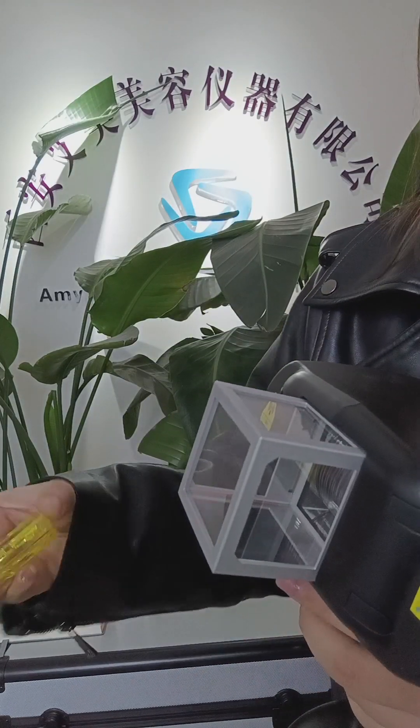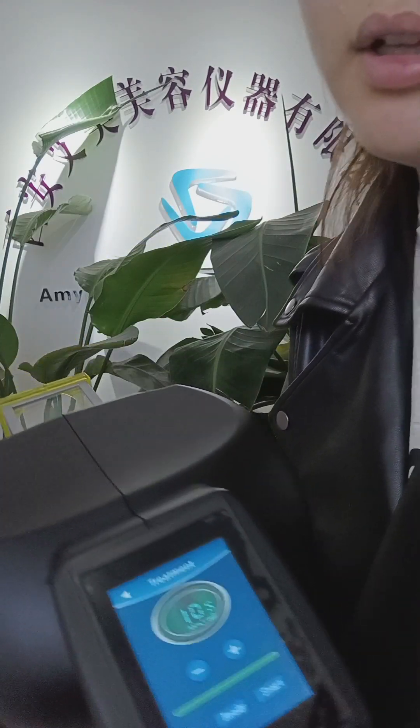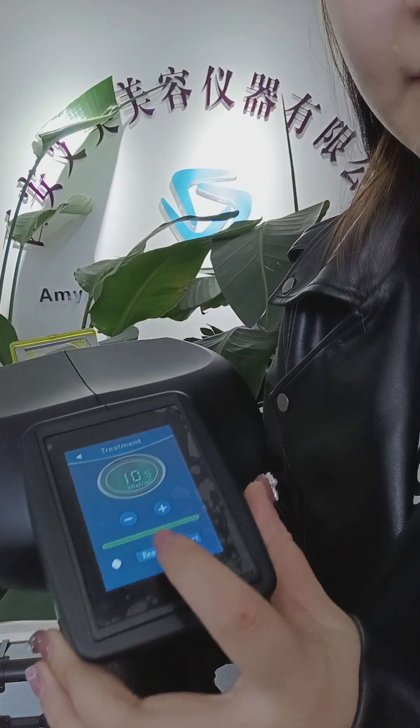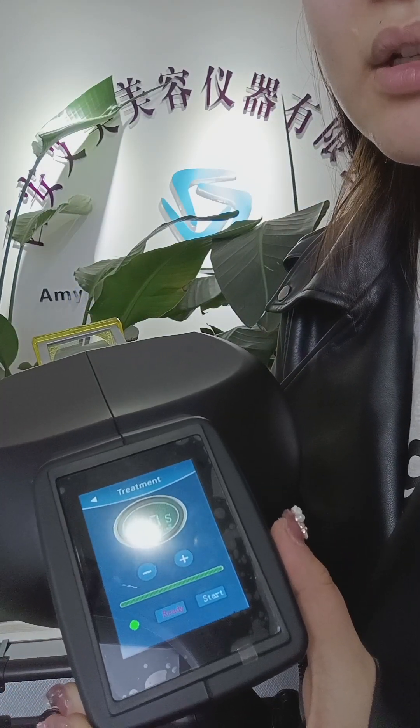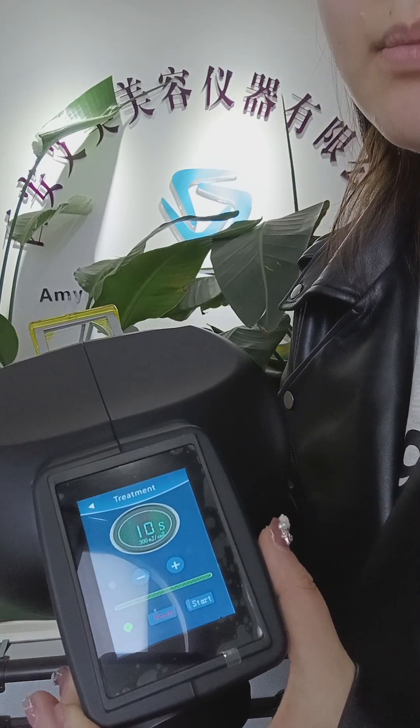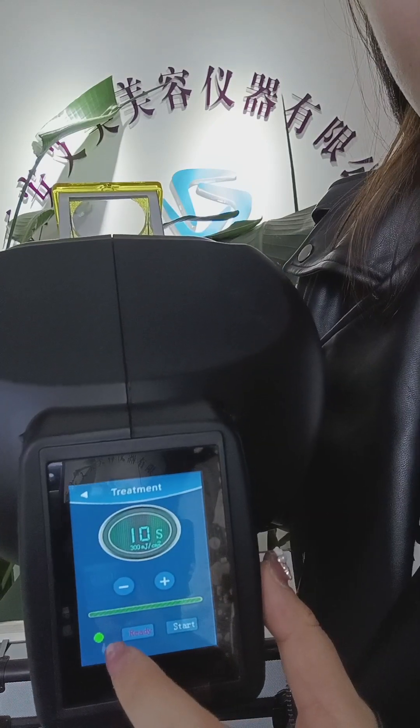you need to put this on. Then press the ready button. The indicator light on the screen will turn green after the system is ready. This is the green light.